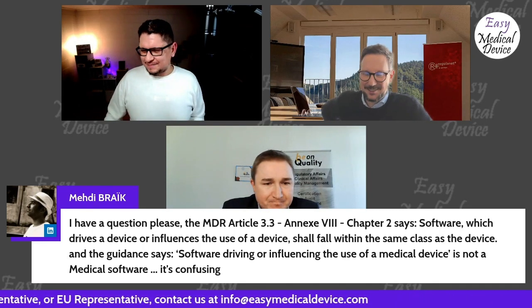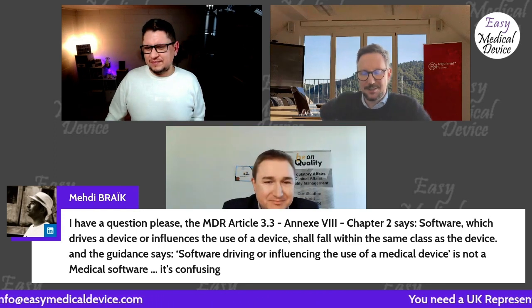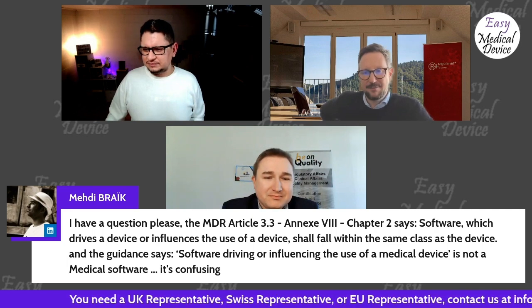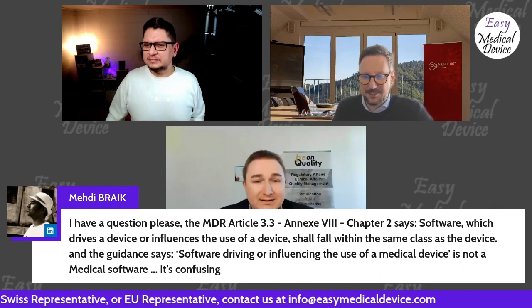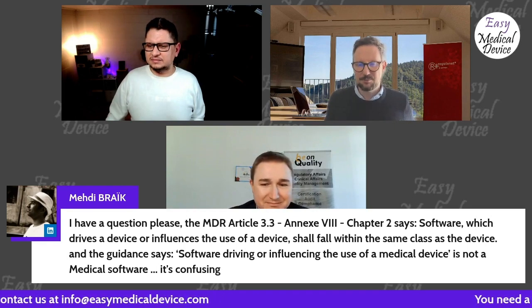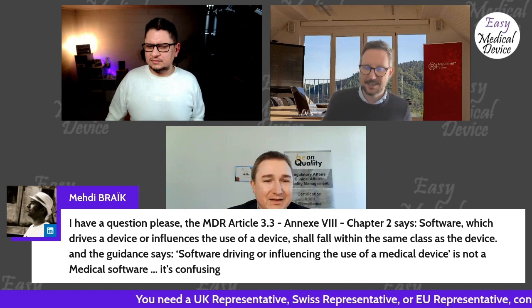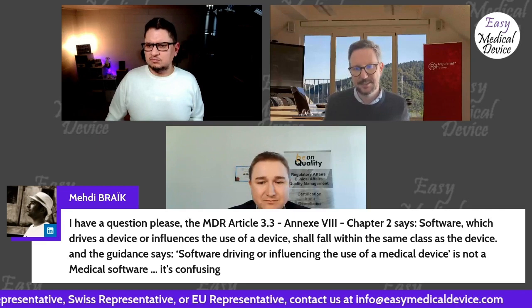So what the MDCG guidance was trying to say is that you have a software, let's say classically embedded in your medical device, and of course, if it tends, for example, to drive it, because it's the software of this device, it doesn't have a user interface, just the firmware internally that drives the device. Then the MDCG guidance wants to say this is not a medical device on its own. You have to see it as a holistic device, and the software should always have a medical purpose on its own or in combination with something else.